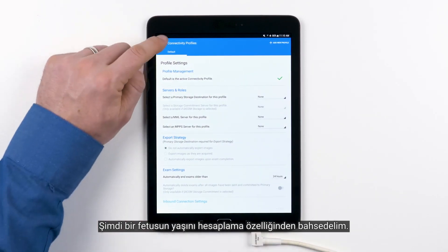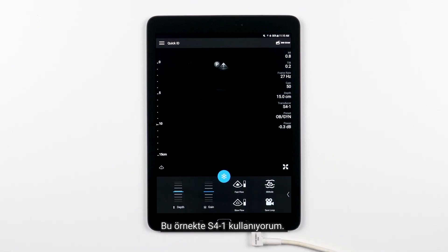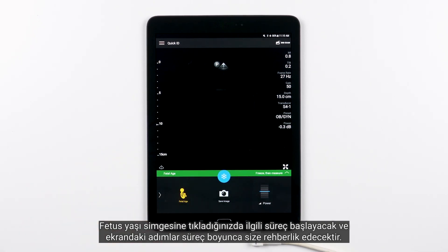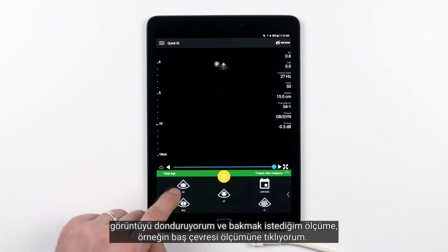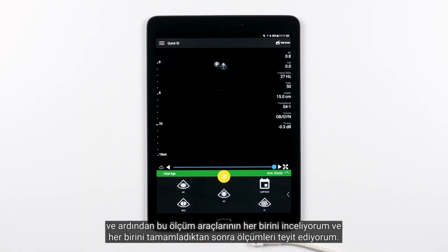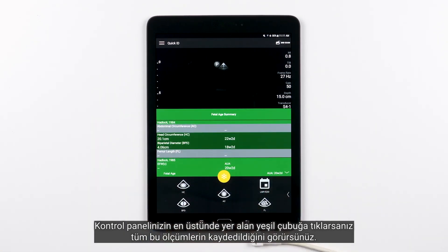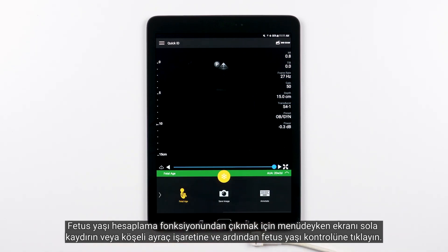Let's talk about the ability to calculate a fetal age. When you are using the OBGYN exam preset, OB fetal age calculations are available. In this case, I'm using an S41. To access those calculations, go to the secondary page by touching the page indicator arrow or swiping the display. Tapping the fetal age icon will initiate that process and the steps on the screen will guide you through. For example, it says freeze then measure, so I freeze the image and tap the measurement I want to look at, such as head circumference. The ellipse measuring tool will automatically pop up on the screen. I'll position it, tap confirm measurement, and go through each of the measuring tools confirming measurements after completing each one. At the end, you'll see all those measurements summarized. If you tap the green bar at the top of your control panel, you'll see all those measurements recorded. To get out of the fetal age calculation function, simply swipe to the left on your menu or tap the chevron sign and then tap the fetal age control.